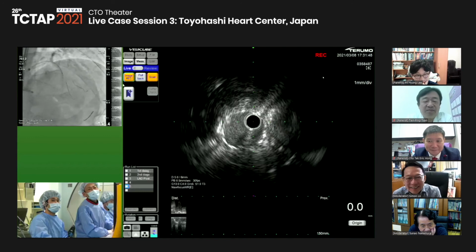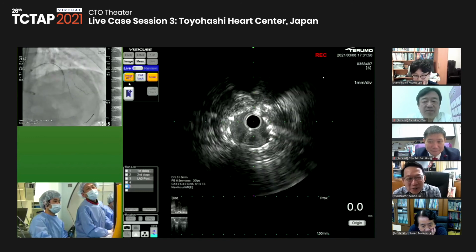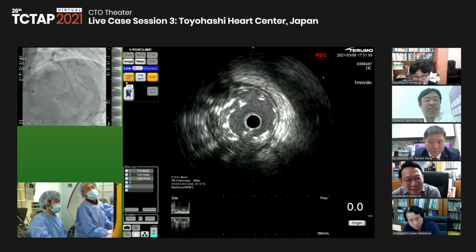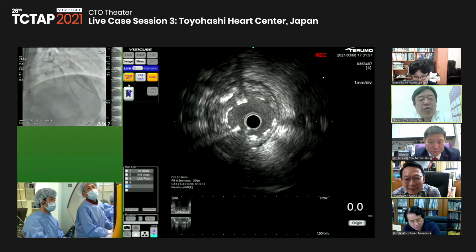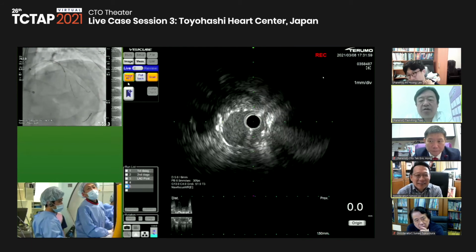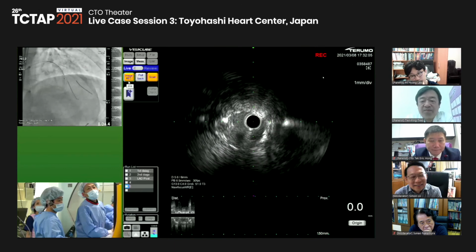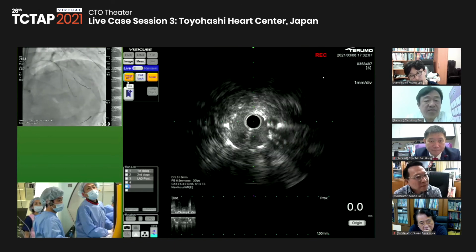Dr. Tsao, would you also do a kissing balloon followed by POT? Yes, this is what I usually do. Kissing first and then POT. Okay, 3 mm is fine.